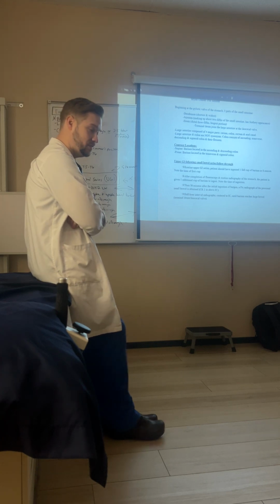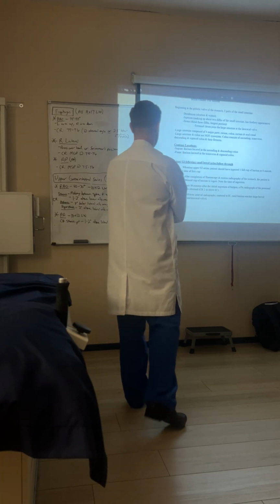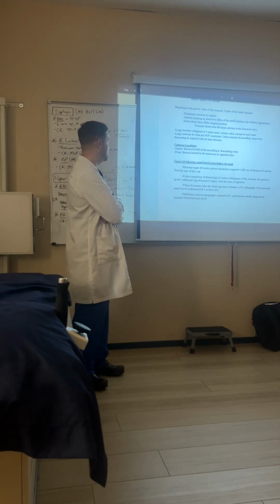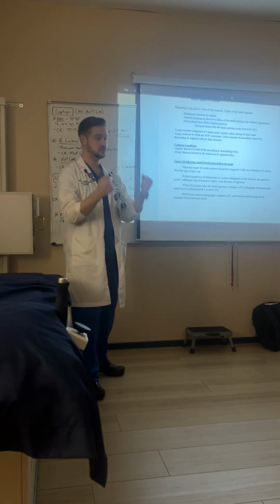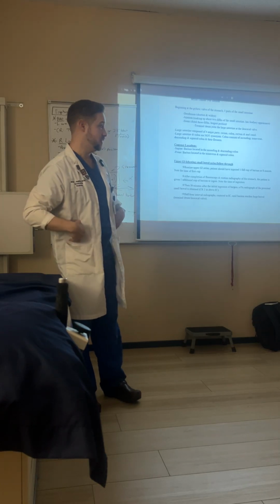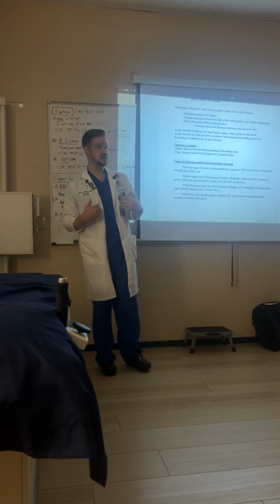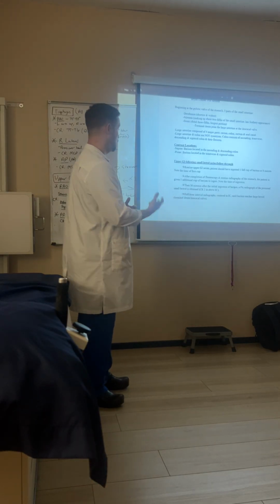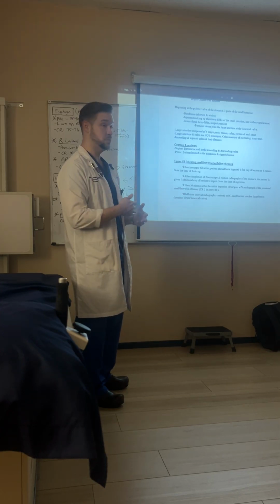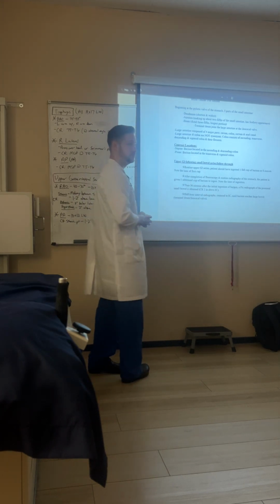Similar to our discussion of the stomach and knowing what body position is going to put the contrast where, we need to have the same knowledge about the contrast in the large intestine as well, okay? So if the patient is supine, we have the ascending and descending colons on the lateral aspects of the abdomen, and the barium will fall into those most dependent areas, okay? If the patient is prone, then the contrast is going to flow into the dependent areas in that position, which would be the transverse colon and the sigmoid colon, okay?